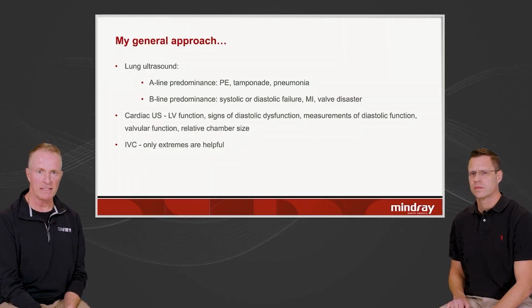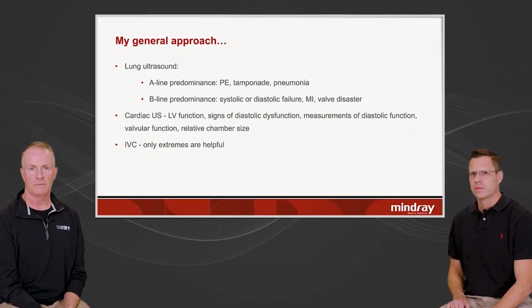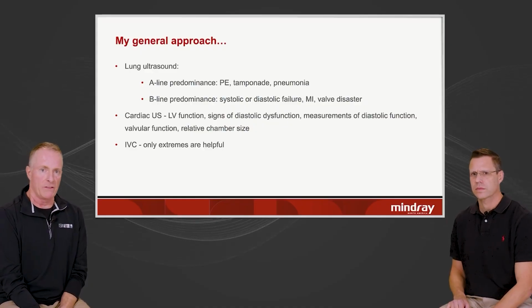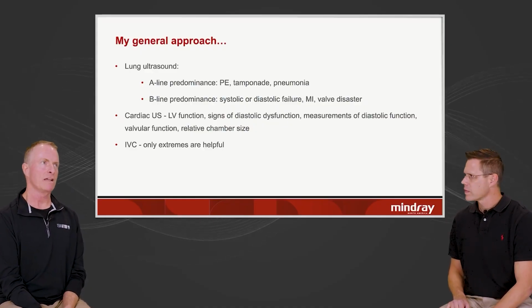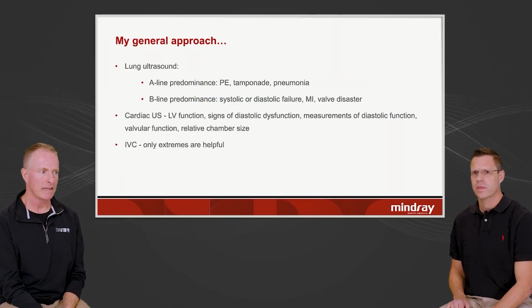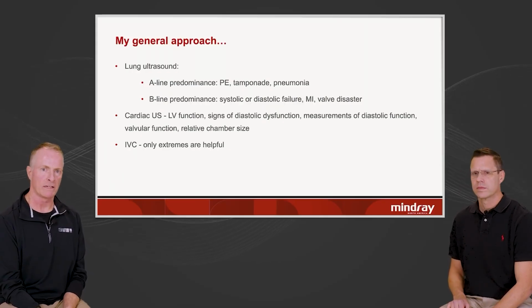And the IVC can be helpful. For example, if you see somebody with a pericardial effusion, and you think it might be tamponade, and you go look at the IVC and it's small, can't have tamponade with a small IVC. So that's when it's helpful. It's not helpful in everybody, though.